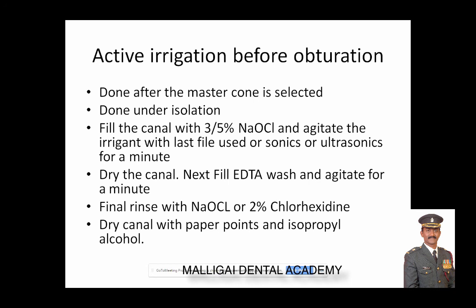What is EDTA wash? Nothing but liquid EDTA, 17%, is next filled into the canal, and it is again agitated for another minute. So 1 minute of 3 to 5% sodium hypochlorite is alternated with 1 minute of liquid EDTA 17% and agitated for a whole minute.